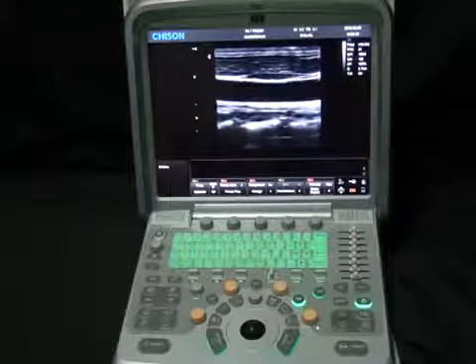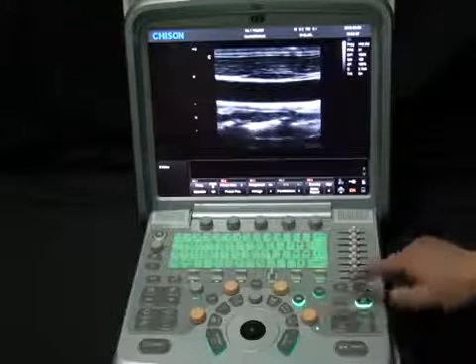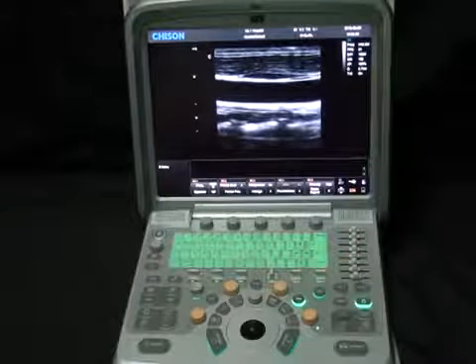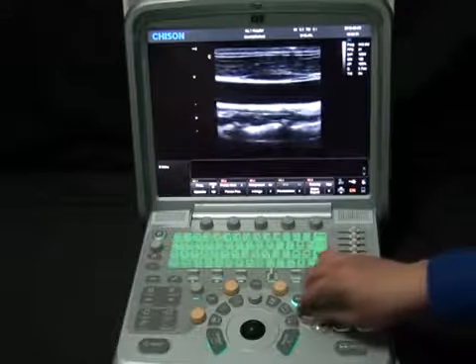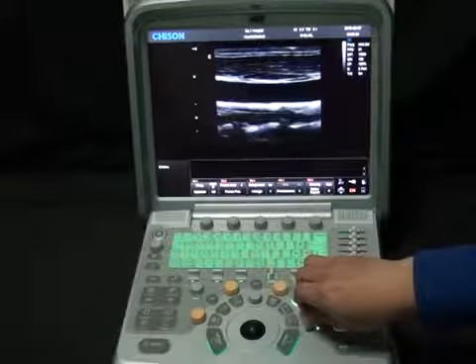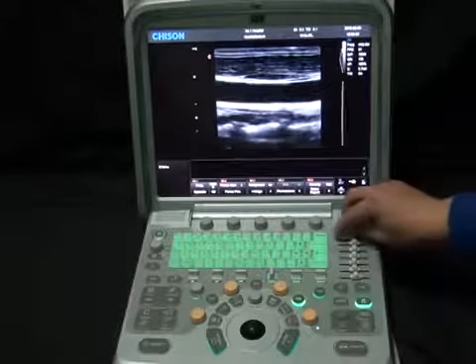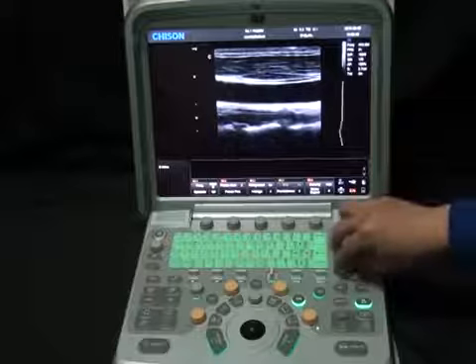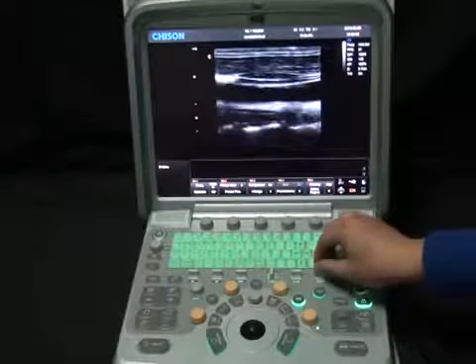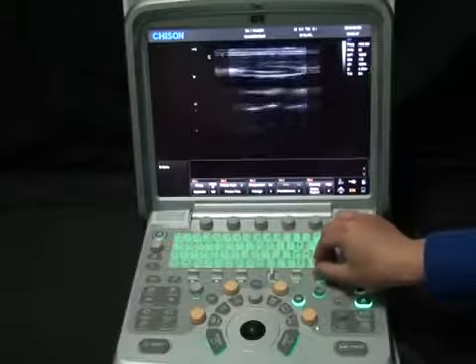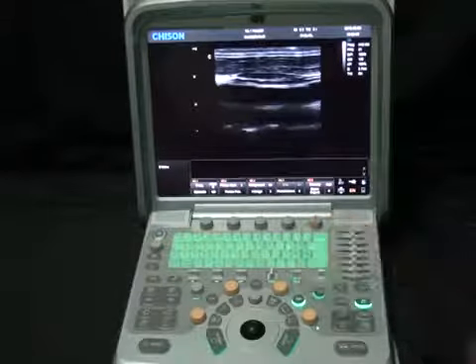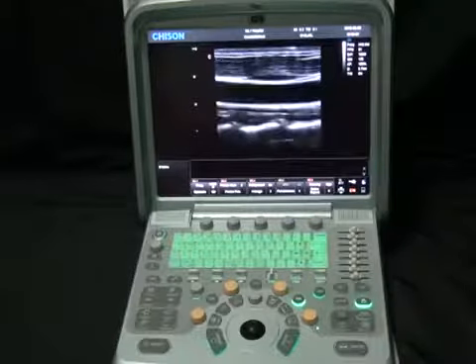Now we are in B mode. In this mode, we will adjust the gain, depth, and focus position to make the image more suitable. Twist button B to adjust the overall gain, while sliding the different segments of TGC changes the gain at different depths. Slide the depth pedal up and down to adjust the depth, and the focus pedal up and down to adjust the focus position.